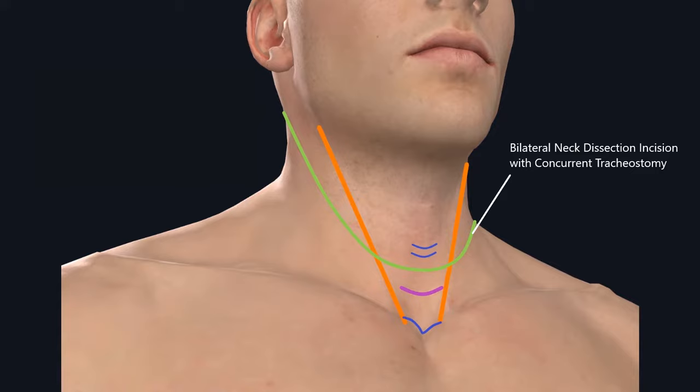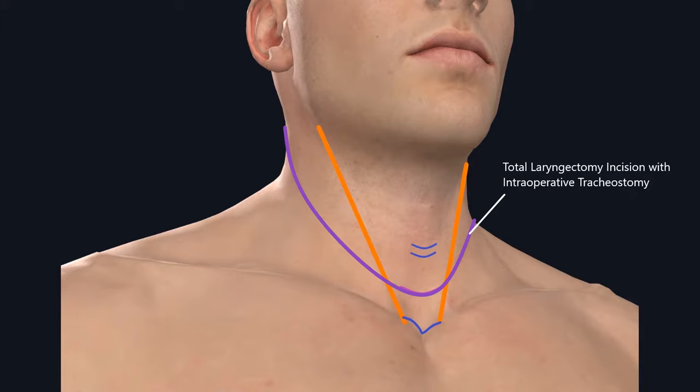Another thing to keep in mind: if you're performing a modified neck dissection, you want to make sure that the neck apron incision does not communicate with the tracheostomy incision. The exception to this rule is when you're performing a total laryngectomy with bilateral neck dissection. In that case, the tracheostomy incision will be included as part of the apron incision for total laryngectomy.